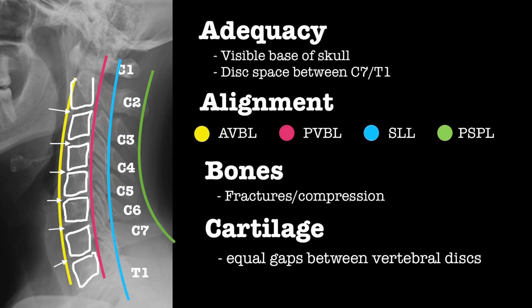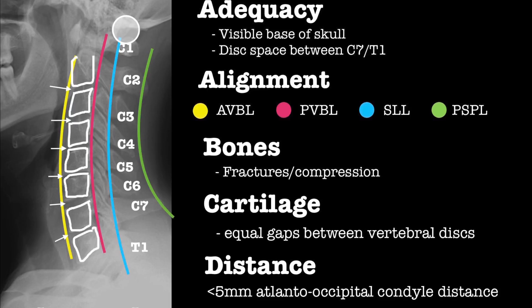C is for cartilage — ensure that there are equal gaps between the vertebral bodies. D is for distance: the distance from the occiput to the atlas should be less than 5mm. If increased, there's likely an atlanto-occipital dissociation.